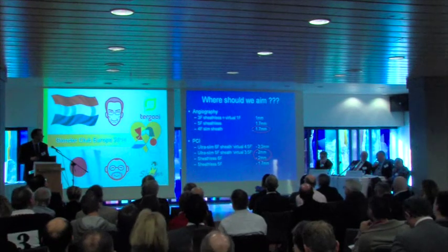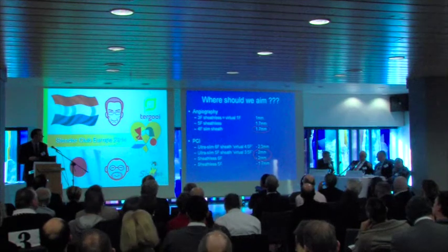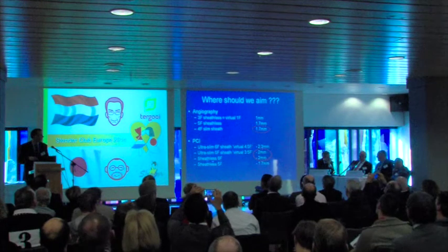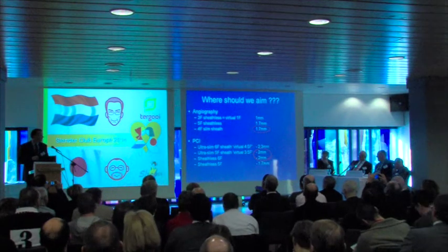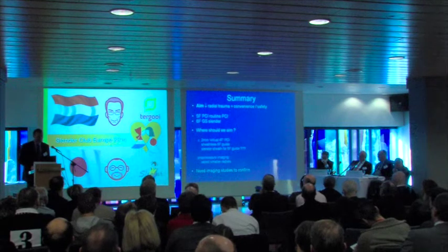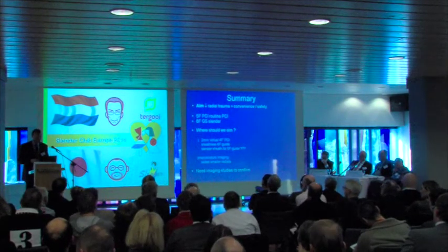For angiography, perhaps we could aim lower than that. To aim for 2 millimeters for our interventional systems, then we either have to be using very, very low diameter sheaths, or we have to be using sheathless techniques. So I don't think that we're quite there yet in terms of the technology.